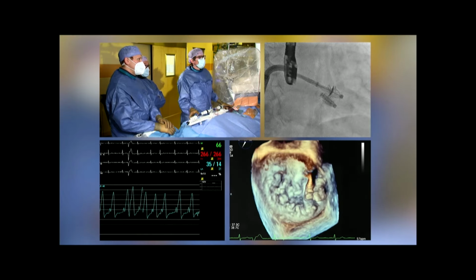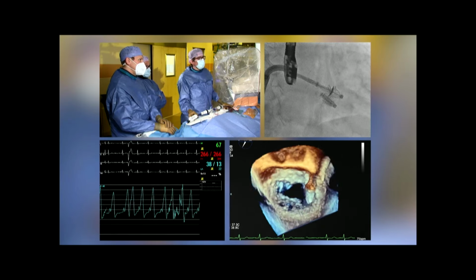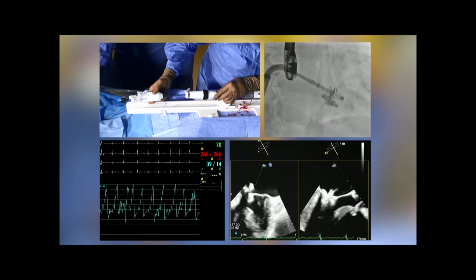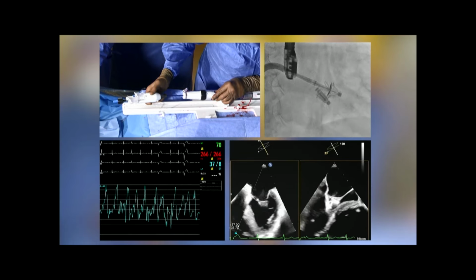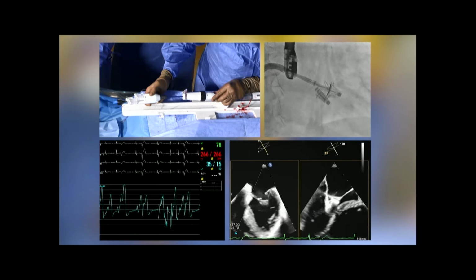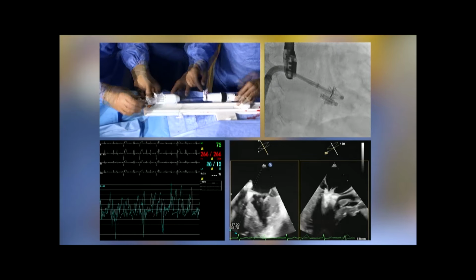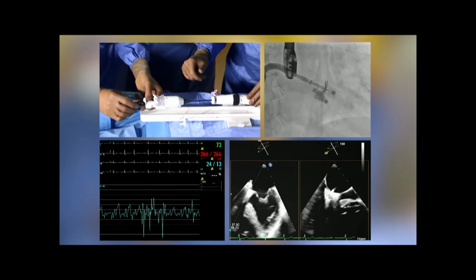Clocking anterior, you're very close to the first device. So clocking is fine, right? No, I think it's good. All right. Explain. So here you see that posterior, we are above. Go in now gently, because we are in proximity to the first, and we have one already down. Now you see the device rolling. So either we wait until it sorts itself, which it did. I think now it's not rolling anymore. It's curling because it's so long. We bring it down. All right. And then I think we are fine to close it.